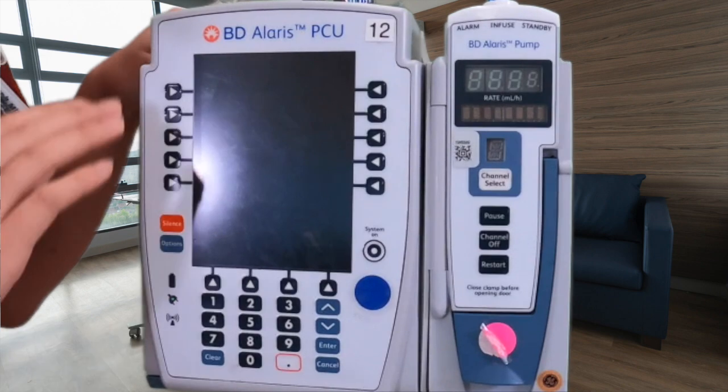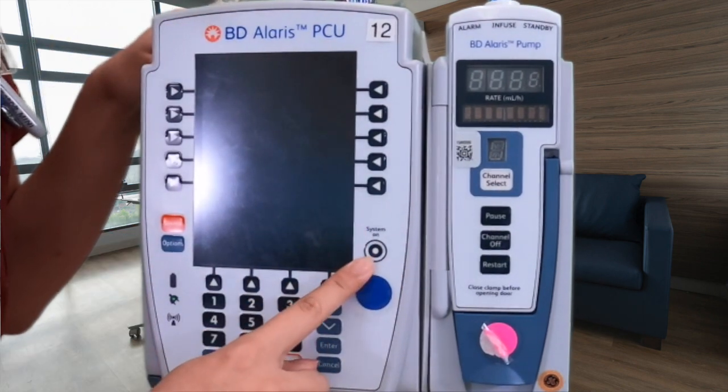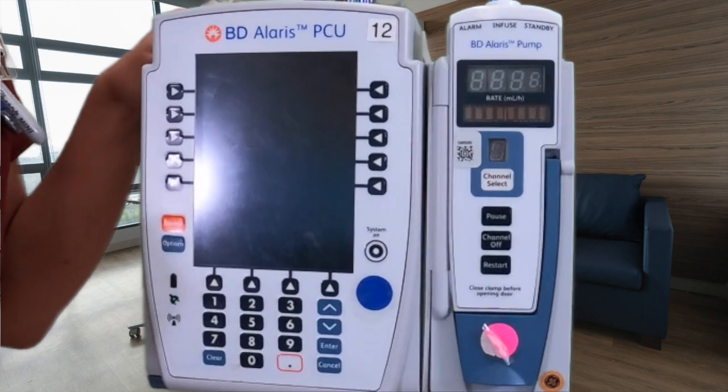Now that we are at our pump, to turn it on we have 'system on' and we just click the button. We do not have to hold it down.